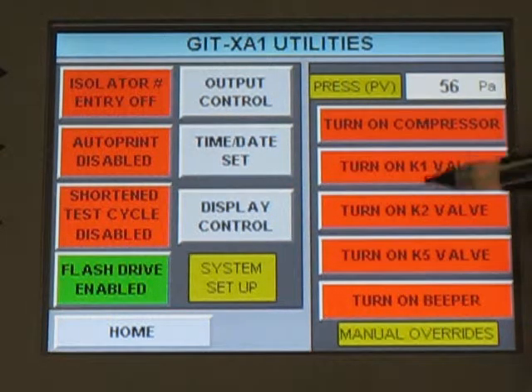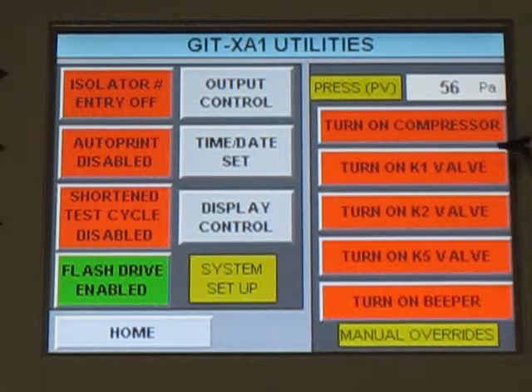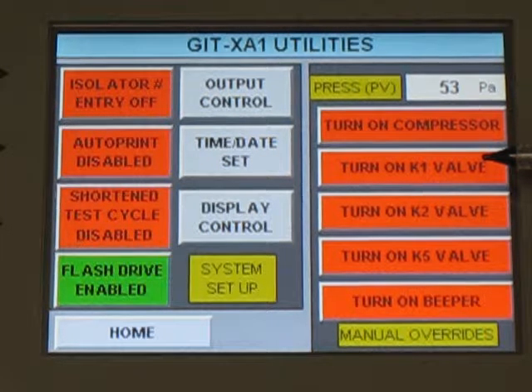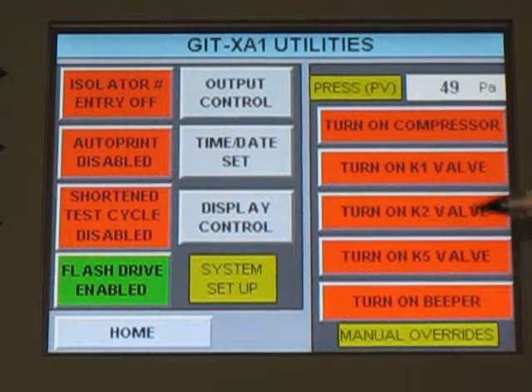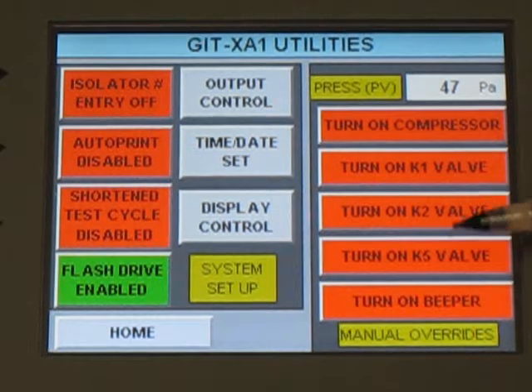But I want to describe a little bit the functionality. Obviously, compressor is what creates the pressure inside of the glove. The K1 valve is the inflate valve, and that's the valve that when it's open, the compressor is on, of course, and we inject air into the glove to pressurize it. The K2 valve is the quick deflate valve.